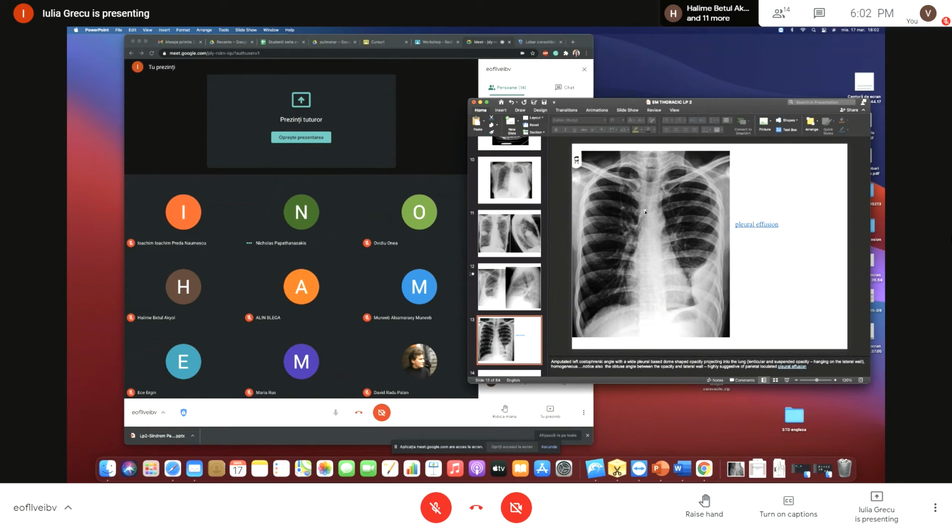So what is the most obvious thing to do if this is made standing? And lateral decubitus. I'm not sure why you complicate the thing a bit. You just have to lay him on his back. Oh, okay. So yeah, lay him down on his back.